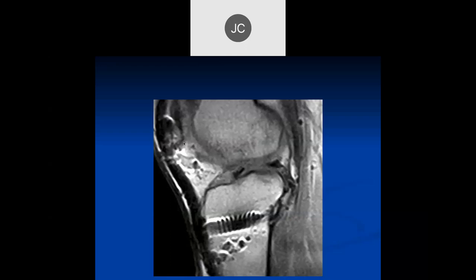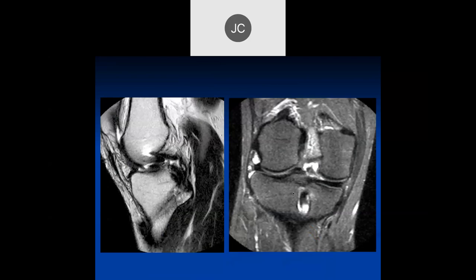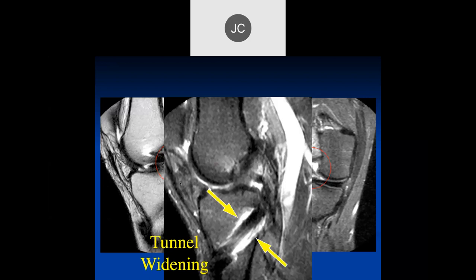We're looking at a PCL graft that's way too inferior for the tibial tunnel. I don't really see much of a graft here. Here's the tibial tunnel, but the graft is torn right into there - that was a PCL graft tear. That looks like another PCL repair with the tibial tunnel. It looks like there are some fibers distally, but I don't see the proximal fibers. There's also tunnel widening here, and this turned out to be a partial tear. They actually replaced the graft when they went in.